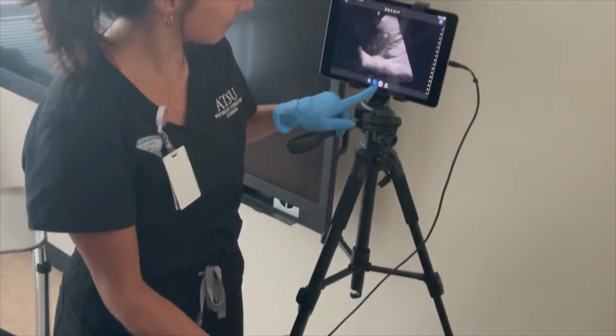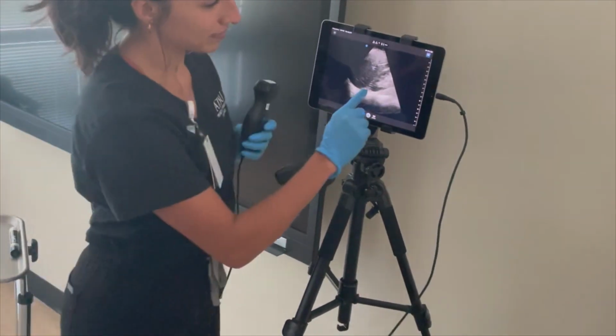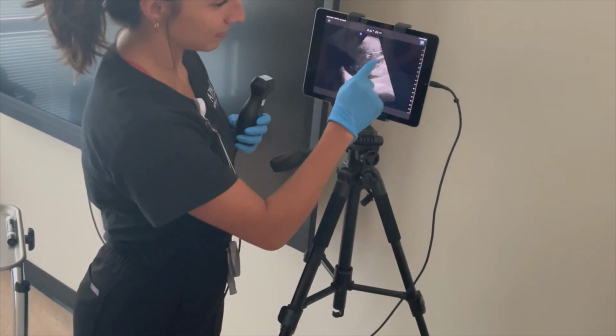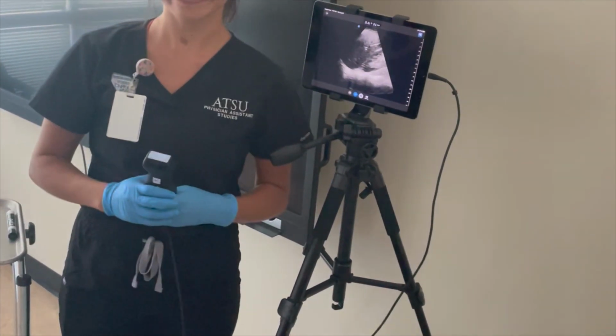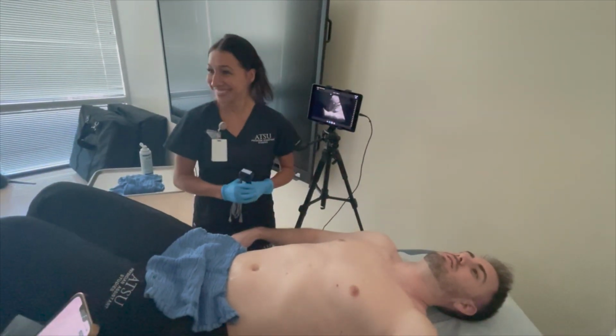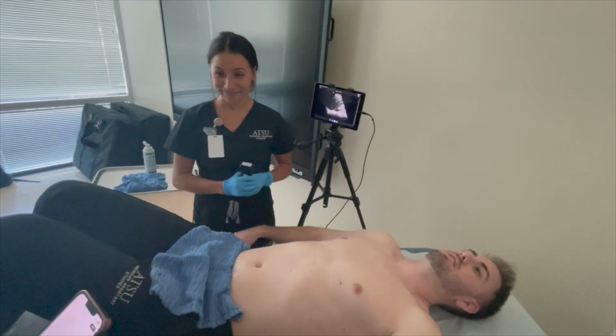We do this to evaluate for free fluid in the Morrison's pouch, or also between the liver and diaphragm, surrounding the caudal tip of the liver. A tip is we can ask the patient to hold their breath in to keep the organs from moving and have the probe fit better.